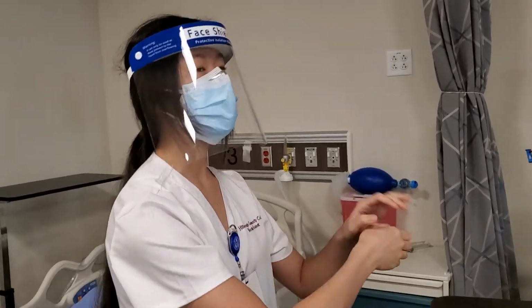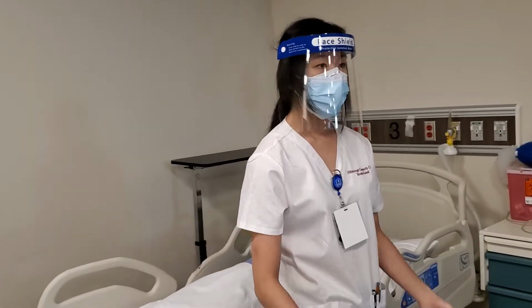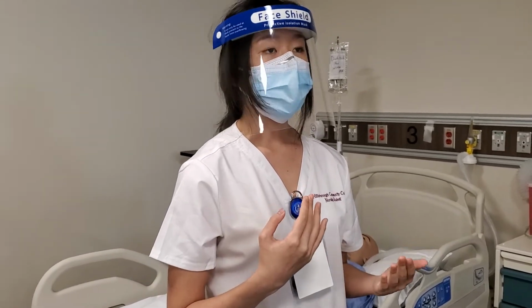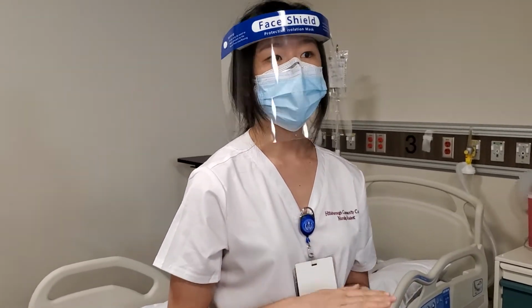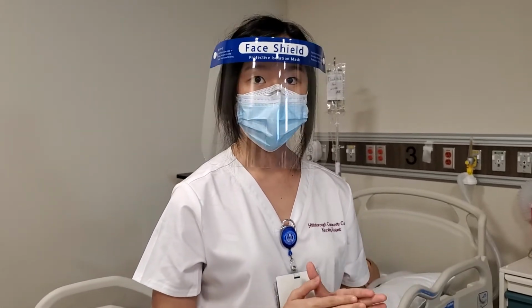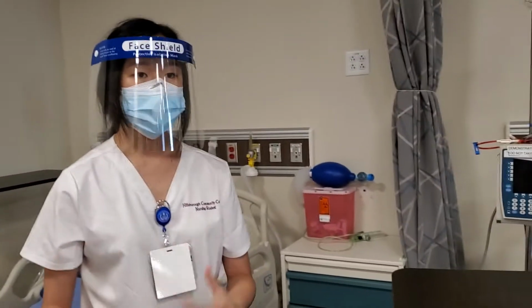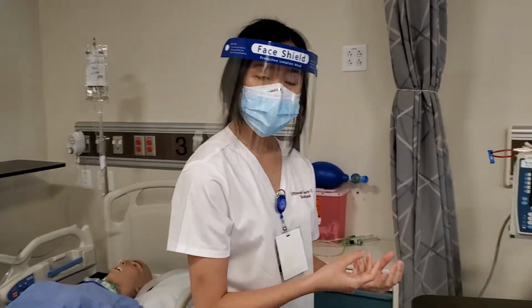Remove my gloves and perform hand hygiene. And now I will go to the blood bank, retrieve my blood, but first I need to identify it with another person there and check that everything matches. So we need the patient's name, birth date, medical record number, the unit number on the bag, the expiration date, blood type, and the blood product type. Okay? And then after we've done that, I will take the bag to my patient.